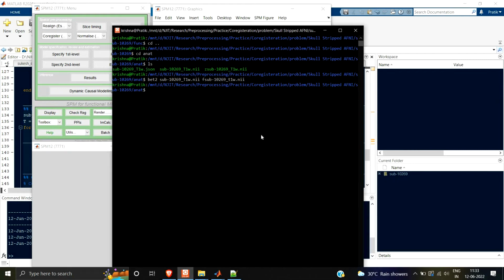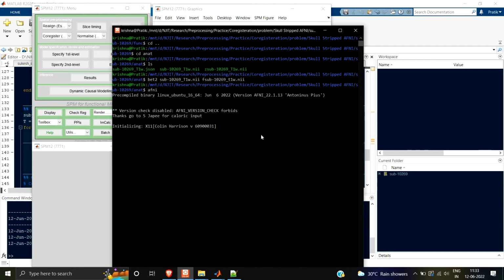Now what you can do is, I'll just show you the different images so that you understand the difference between AFNI and FSL and why one is slower and why the other is fast.